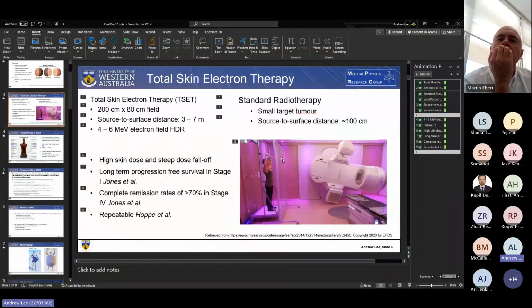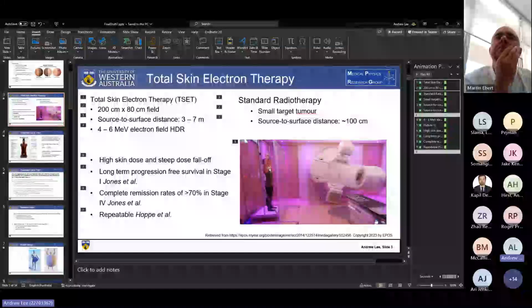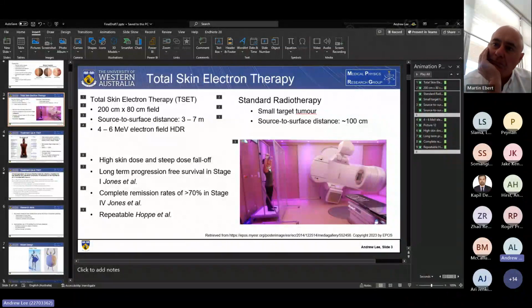So this in general scatters the electrons. So we have lower energy electrons causing a higher surface dose and lower penetration. It also increases the uniformity because the scatter, of course, scatters it in a larger area. So we do expect that with a beam spoiler, your treatments are going to be slightly longer to achieve the same doses, but it increases uniformity and decreases your dose at depth.